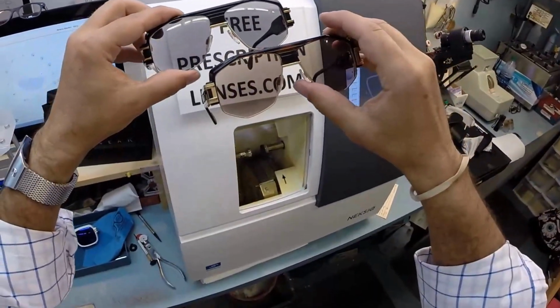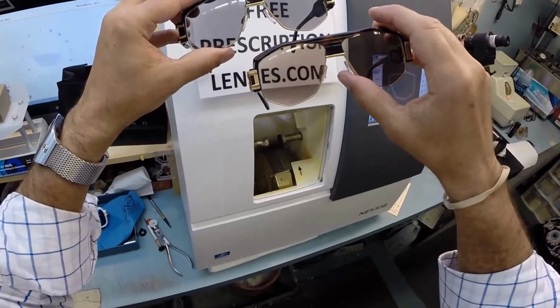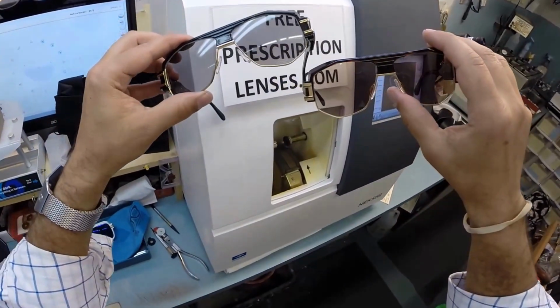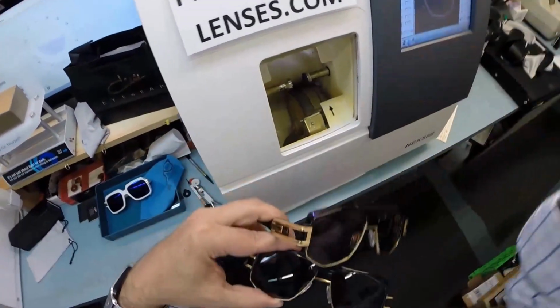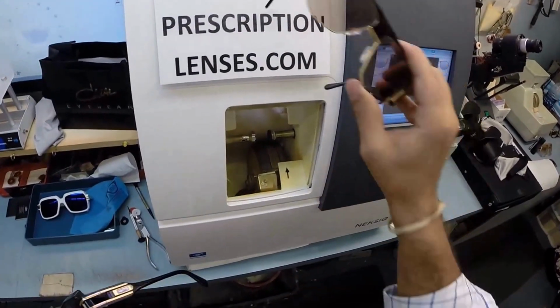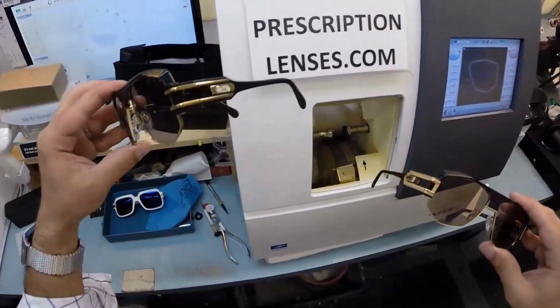So you can see as these lenses start to lighten, a minute from now they'll be perfectly clear. But that is it. If anyone has any questions, just email me at freeprescriptionlenses@gmail.com or simply click the contact me button on the website at freeprescriptionlenses.com.